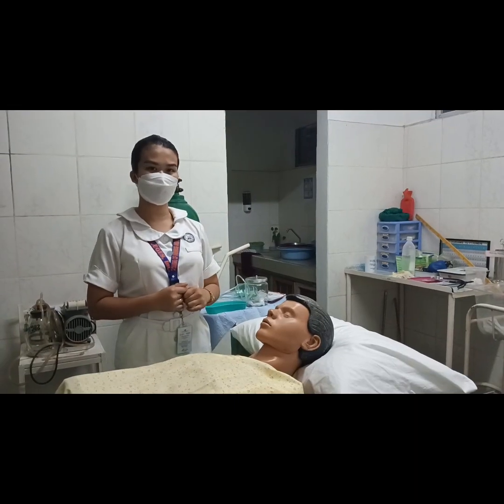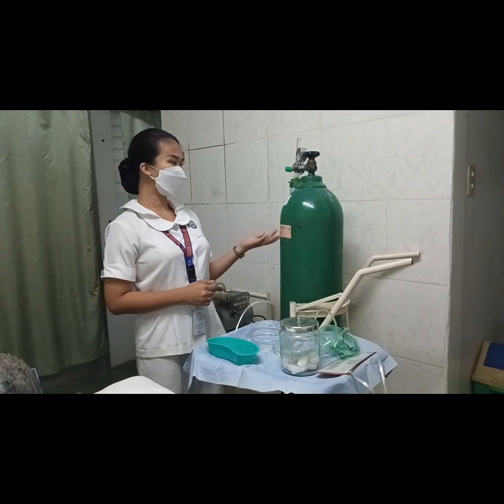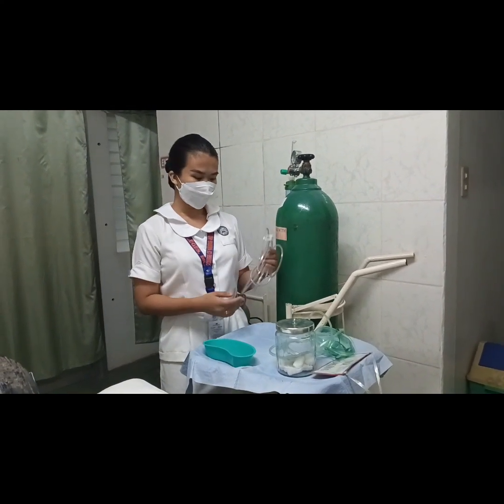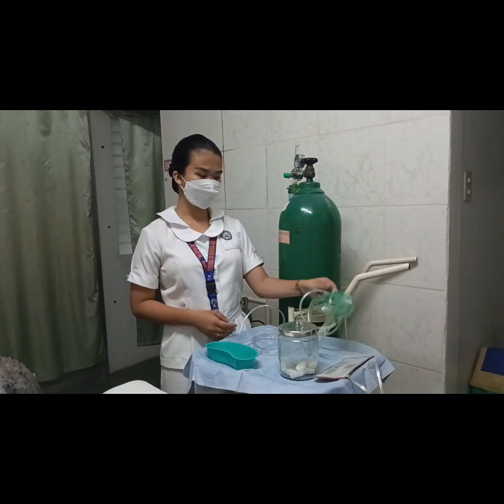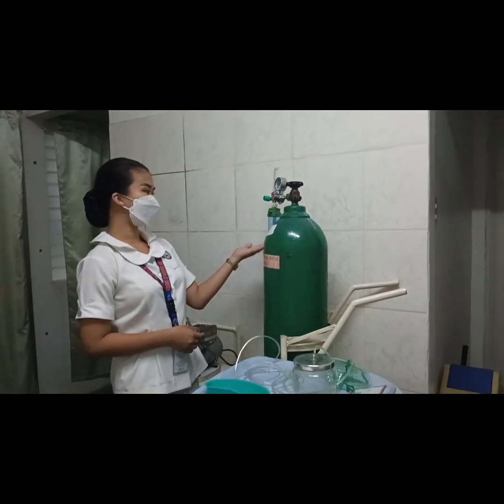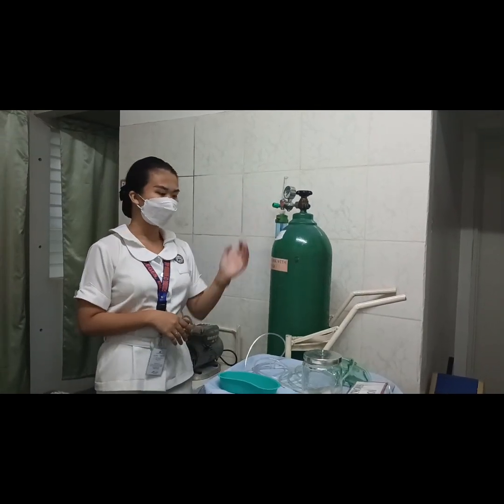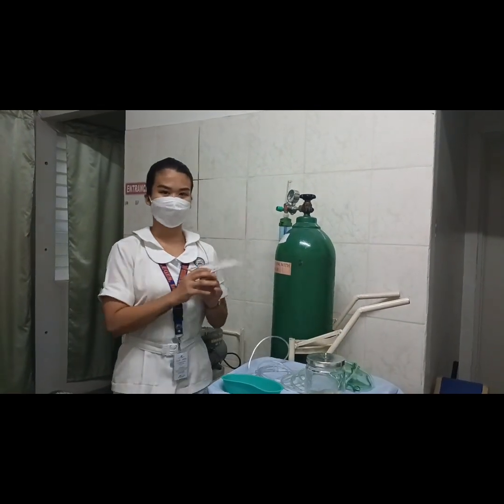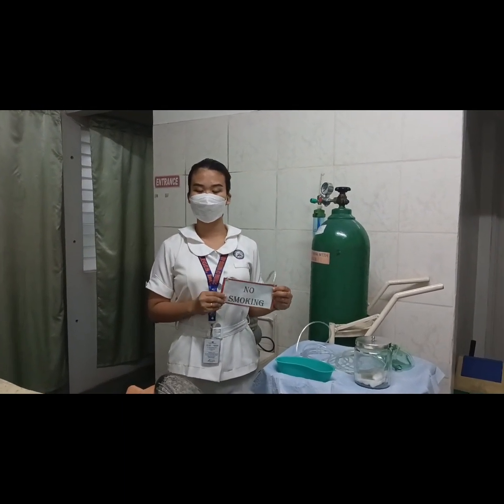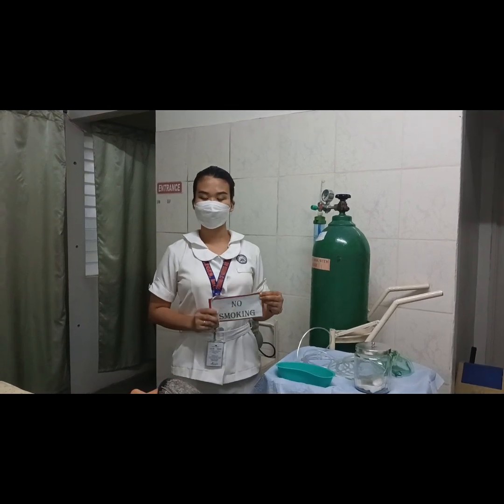Next, I will gather all the equipment needed: the oxygen source, the plastic nasal cannula, the plastic aerosol mask, the humidifier, the sterile water, the oxygen flow meter, and the no smoking sign. I will place the no smoking sign on the patient's door for the awareness of his visitors.